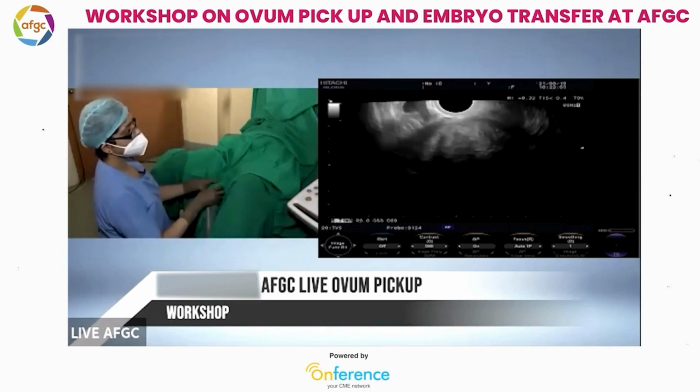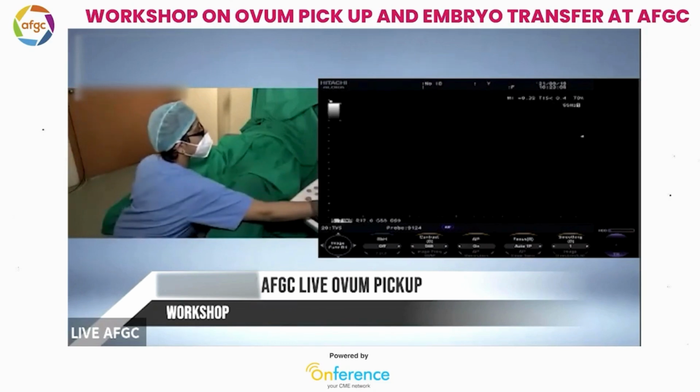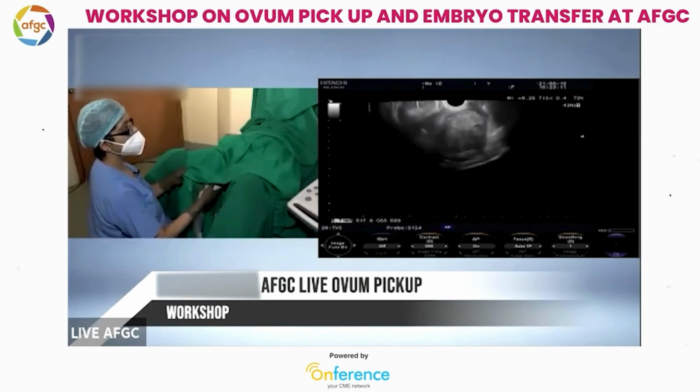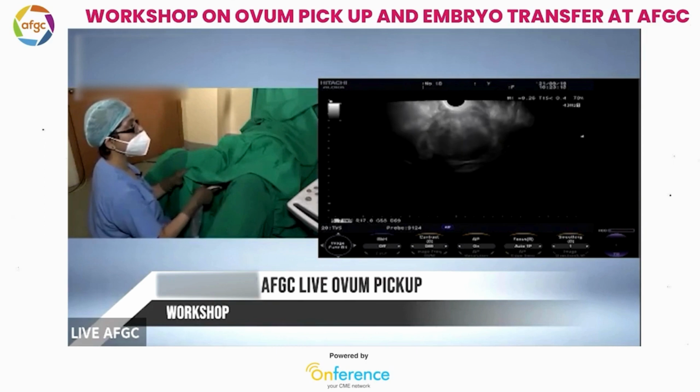You will just see a mass and you will not be sure whether it is adenomyosis or what. So, when there are large masses, always zoom out and always follow it with a trans-abdominal scan, even though she does not have a full bladder.